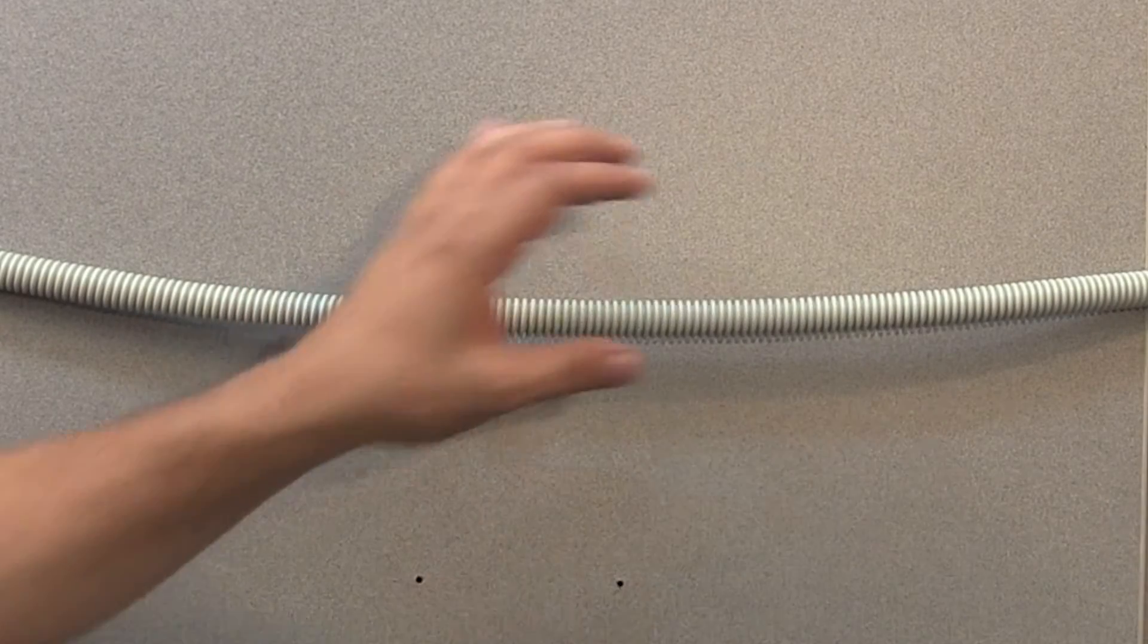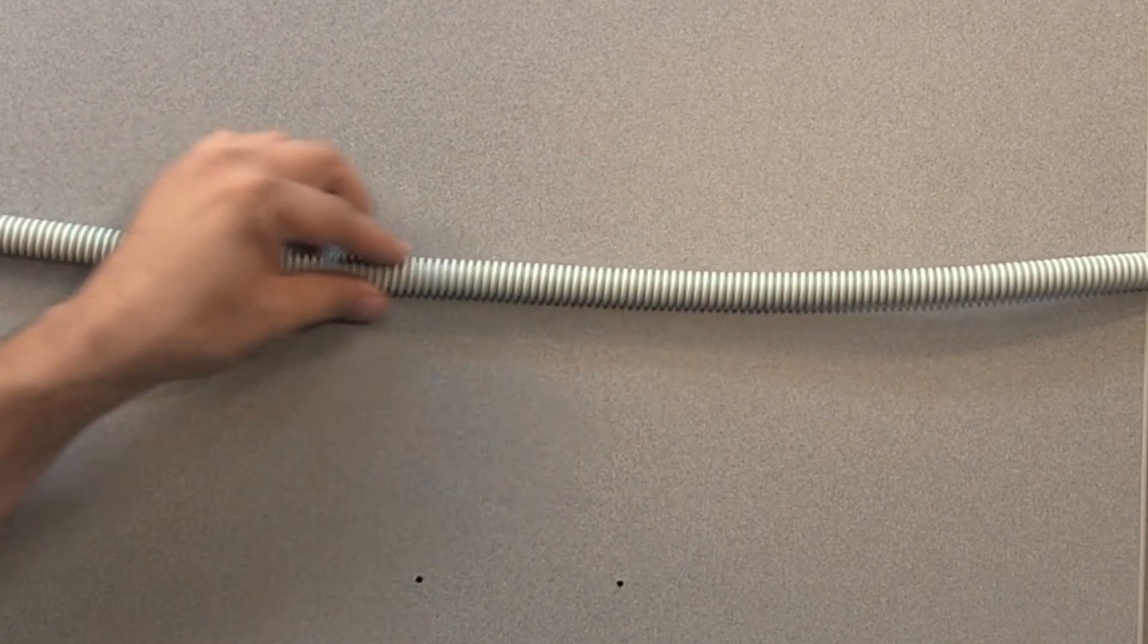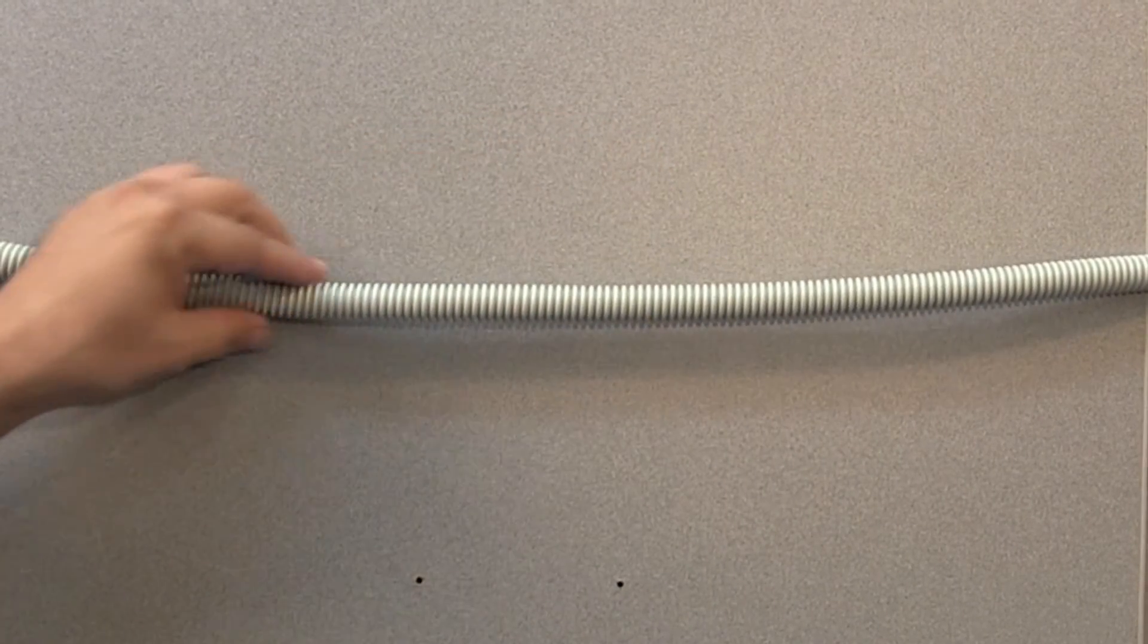We've decided to install our separator on a wall where the flexible vacuum line comes into the room, so we'll use the provided barb connectors.